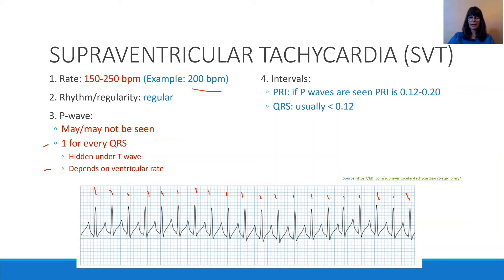We can certainly look at our QRS complexes. I like to start by looking at them when they start at a bigger line box here. So measuring — one, two for the QRS — which makes the QRS 0.08, which is normal, less than 0.12. Therefore, the QRS is normal, and we know that this is a dysrhythmia that has to do with the atria or above the ventricles.